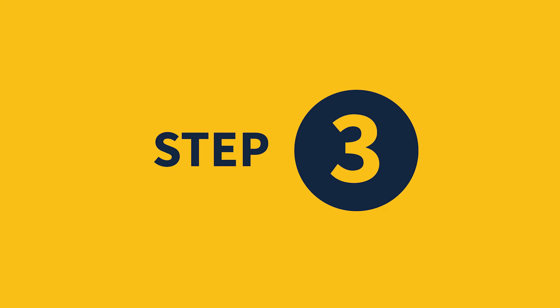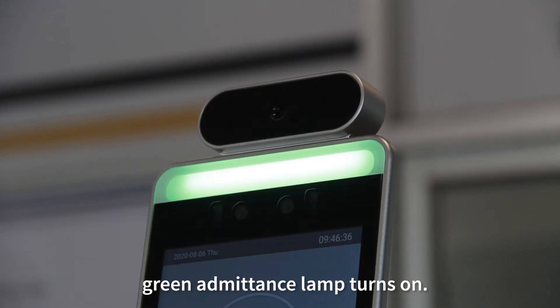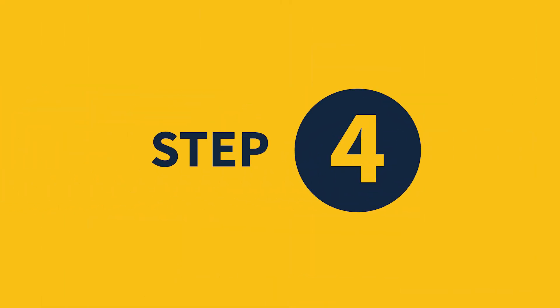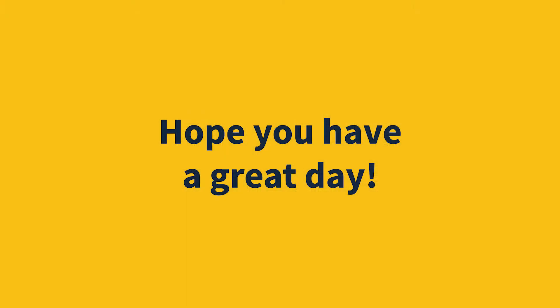Step three: stand still and wait until the green admittance lamp turns on. Step four: you may now enter the campus. Hope you have a great day.